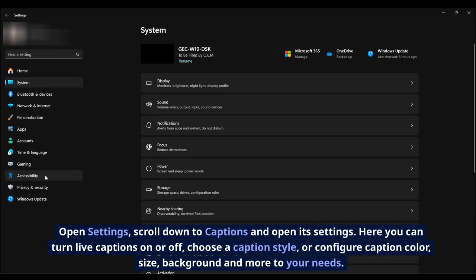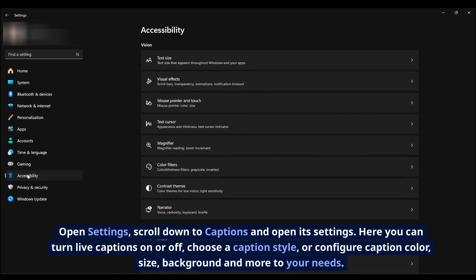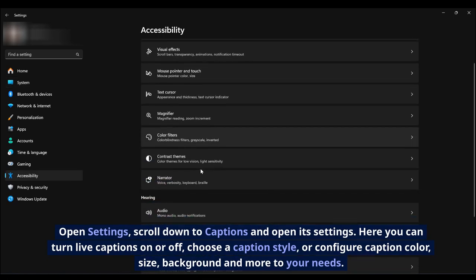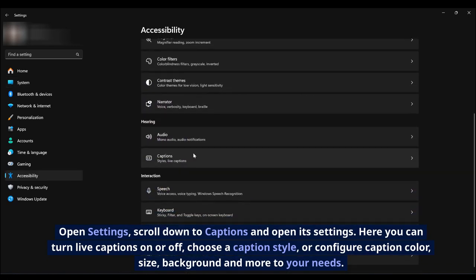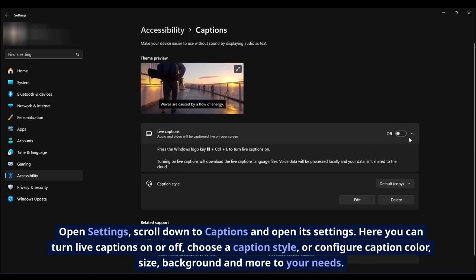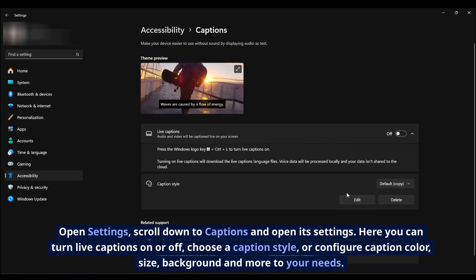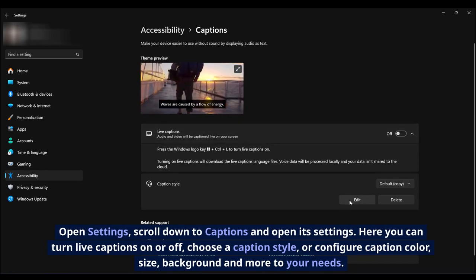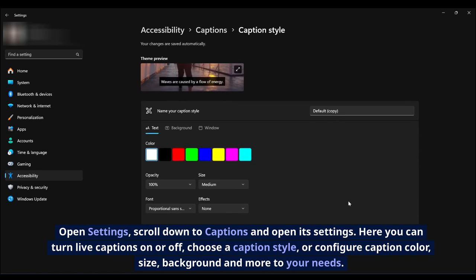Open Settings, scroll down to Captions and open its settings. Here you can turn live captions on or off, choose a caption style, or configure caption color, size, background, and more to your needs.